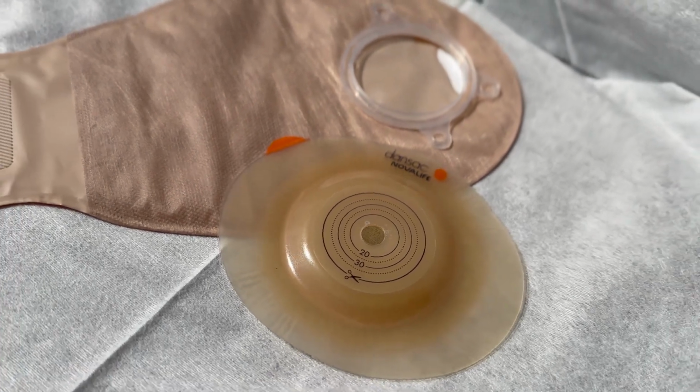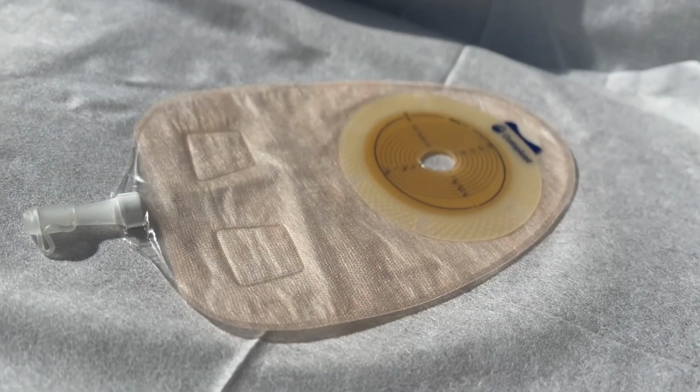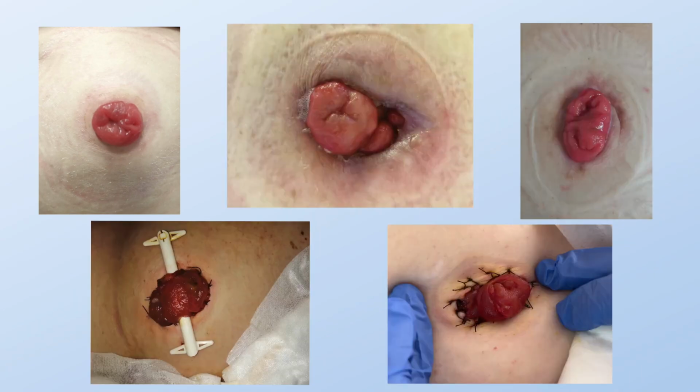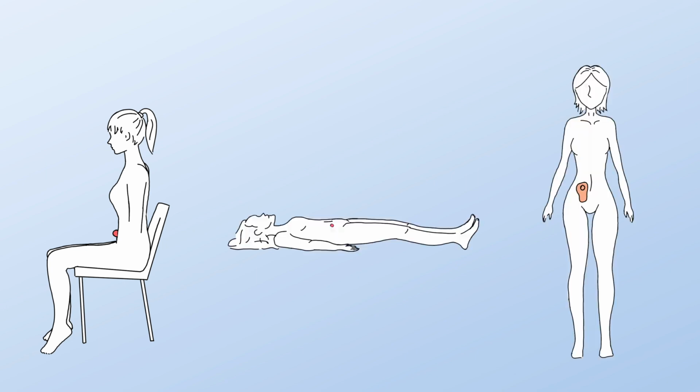Replacement of appliances in uncomplicated stoma. The type of stoma appliance is recommended by a specialized stoma nurse, based on the type of stoma, the patient's physical build, abdominal contours, associated conditions, and manual dexterity in managing the stoma. Patients should be evaluated in sitting, lying, and standing positions to determine the best fitting appliance.